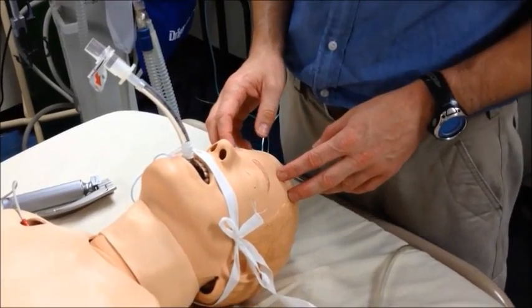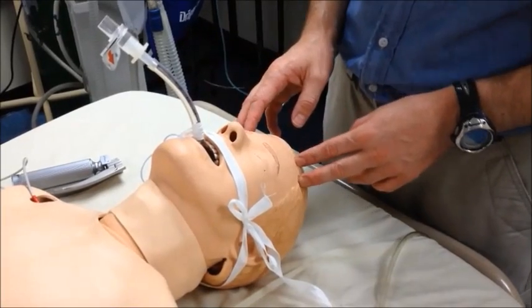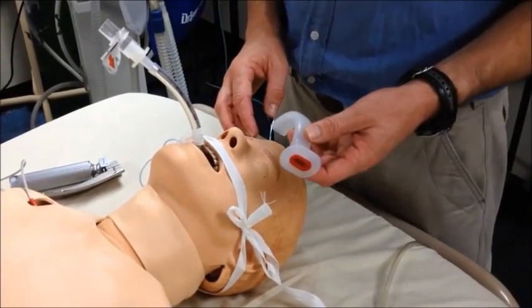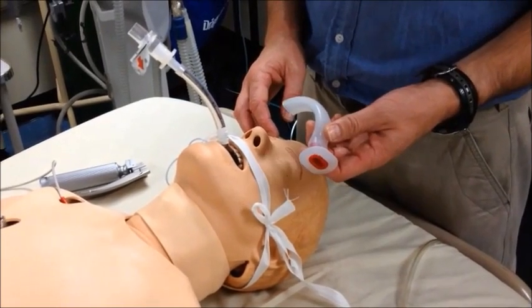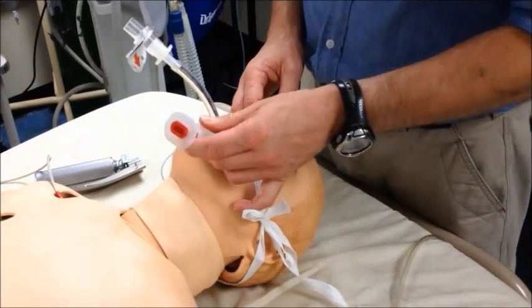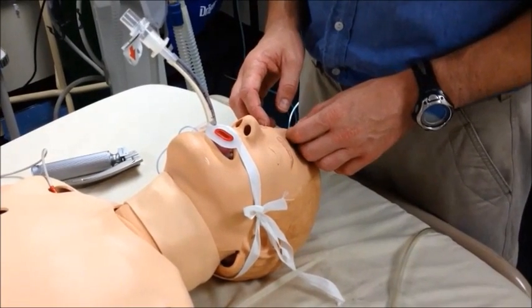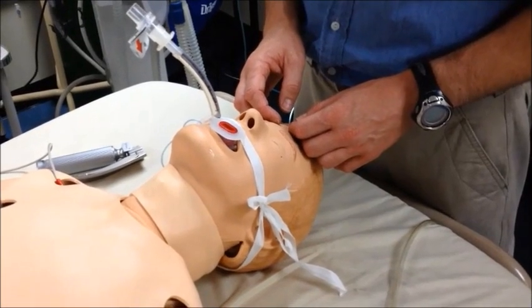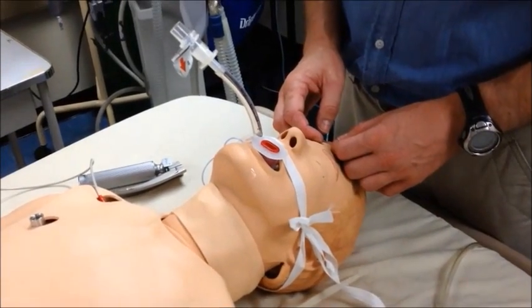A bite block or similar device is handy to prevent the patient from biting and obstructing the airway. If a specific bite block is not available to you, you could consider inserting an oropharyngeal airway. We recommend selecting one size smaller than would normally be used, as the oropharyngeal airway is only serving as a bite block in this case. Insert the oropharyngeal airway as per usual, and make sure that it is removed and changed for a bite block as soon as possible, as prolonged insertion of an oropharyngeal airway in a ventilated patient is associated with tissue destruction and ventilator-associated pneumonia.